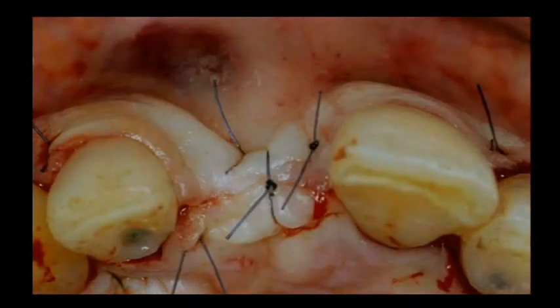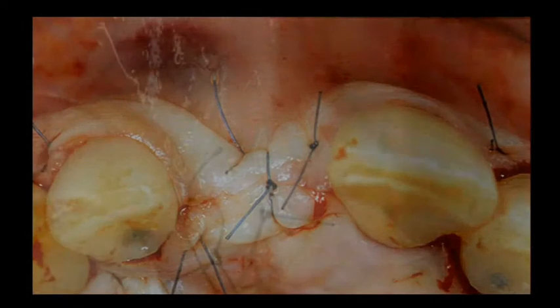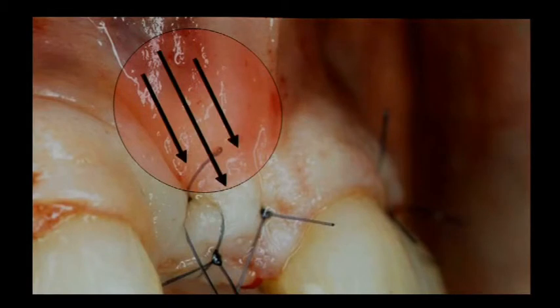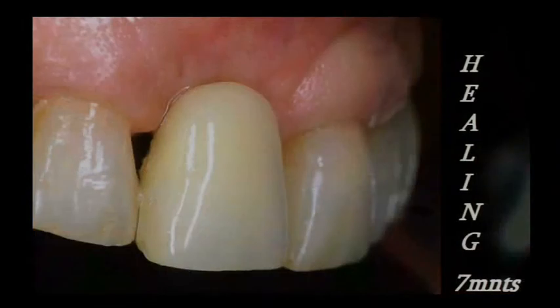I use the GBR technique, autogenous bone combined with a non-resorbable membrane, which is, in my opinion, still the state of the art in these big defects, as you just have seen underneath this membrane and the bone graft. And then you can see here during the closure that even if you are able clinically to recreate thick bone, and buccal bone as well, this is really not enough.